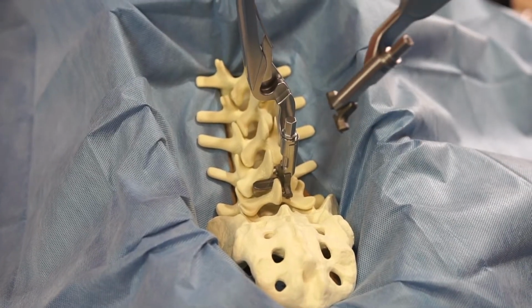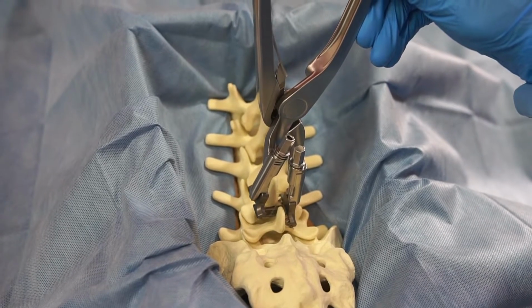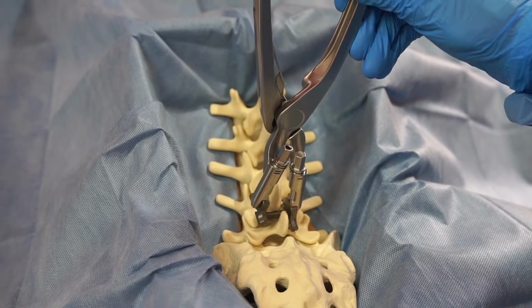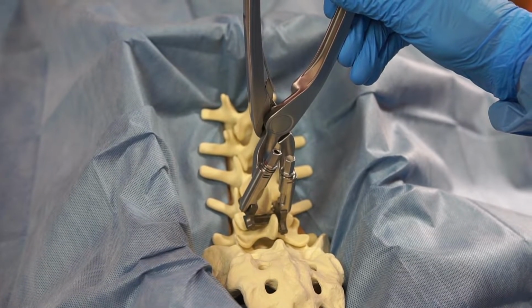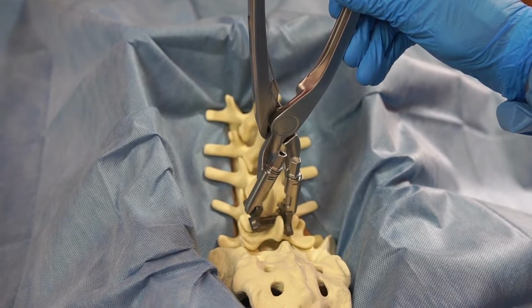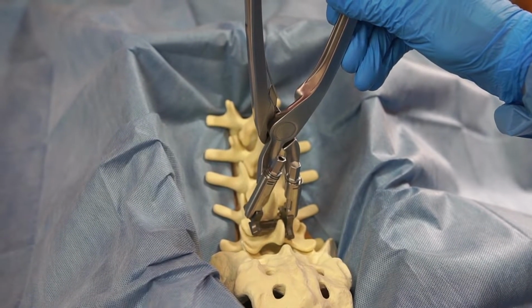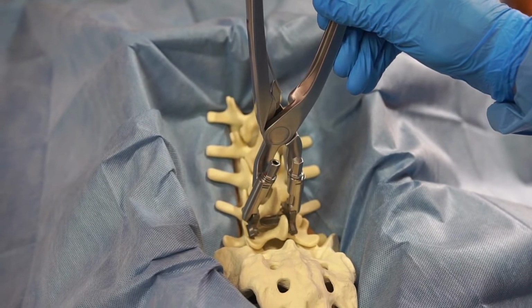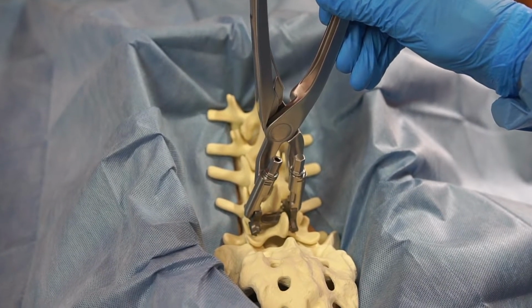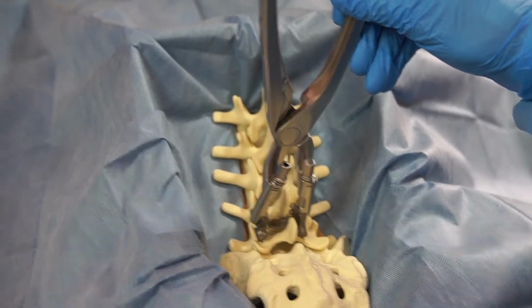Insert the lock plate side of the implant into the surgical site while lining up the pivot joint in the middle of the PG inserter compressor and aiming just past the end of the tray so that the slot can engage the tray. Engage the second arm into the first arm of the PG inserter compressor until it engages securely and locks into position. You will hear a click when fully seated and engagement occurs.